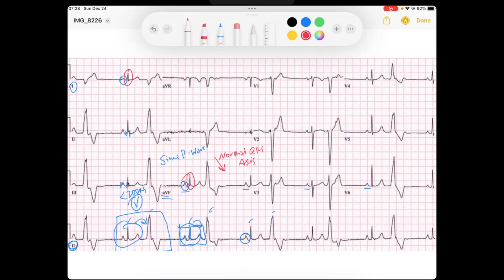I look at my ST and T waves throughout the leads — lateral leads, which are 1, AVL, V5, V6; inferior leads, which are 2, 3, and AVF; septal leads V1 and V2; and anterior leads V3 and V4. Things seem to look okay. So we've said that these are sinus beats.